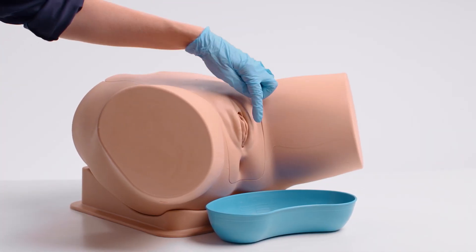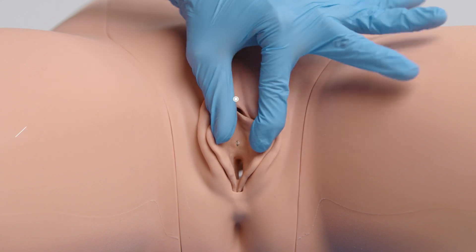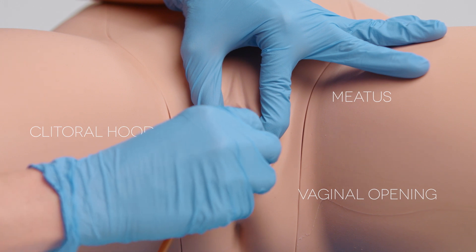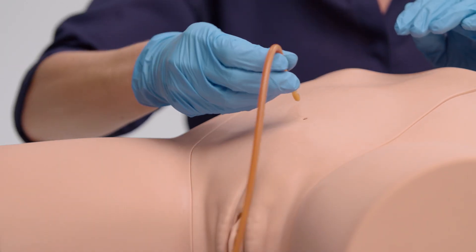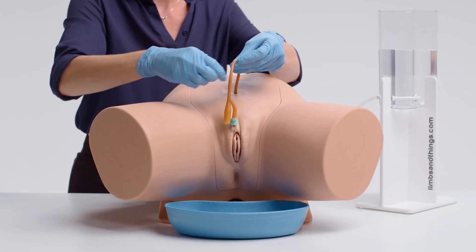The female module has a soft labia, allowing trainees to practice parting using the aseptic no-touch technique. The vaginal opening allows for incorrect insertion of the catheter. It also allows for management and care of pre-inserted suprapubic catheters via the pre-ported bung.